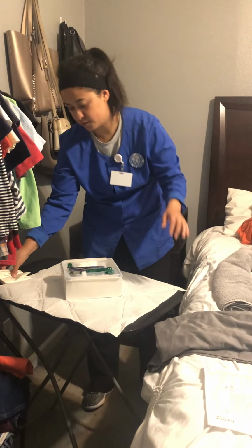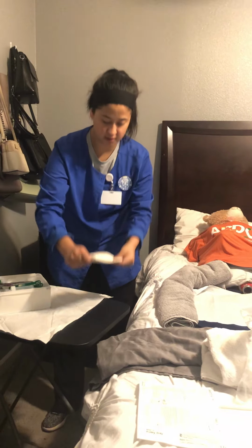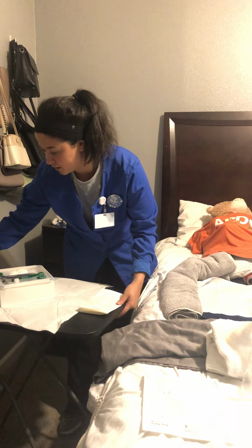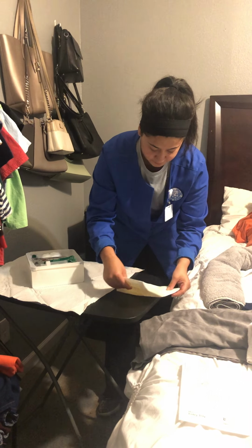Okay, I am now going to scoot this over a little bit. Get my sterile gloves ready. Oh, perform hand hygiene before I put my sterile gloves on. I don't have a lot of room, so let's see. Only touching 1 inch into the paper.